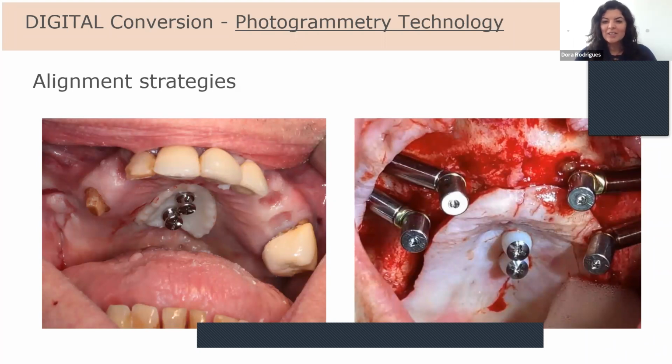I cannot go to my doctors or surgeons and ask them to just screw some extra parts or alignment markers into the patient's mouth because it will make my life easier with additional workflow. I can do this, but it's just as a reference. If it's a doctor that has an in-house lab and is doing large cases in-house, this is most of the time what they do.